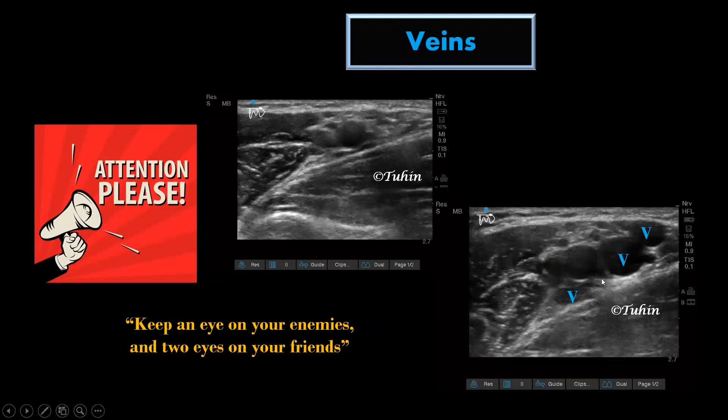Can you tell the difference between these two photographs? They are the same, except one is with compression and another is without compression. During performance of the axillary brachial plexus block, try to keep the pressure over the probe as minimum as possible so that the veins remain open. If the veins are compressed, and your needle tip is inside a vascular structure, on aspiration you may not get any blood because of the pressure over the veins. Frequent aspiration and slow injection are two important factors to decrease the risk of IV injection and subsequent local anesthetic systemic toxicity. If no spread is seen on ultrasound image despite local anesthetic injection, the tip of the needle may be located inside a vein — immediately stop the injection, withdraw the needle, and reposition.